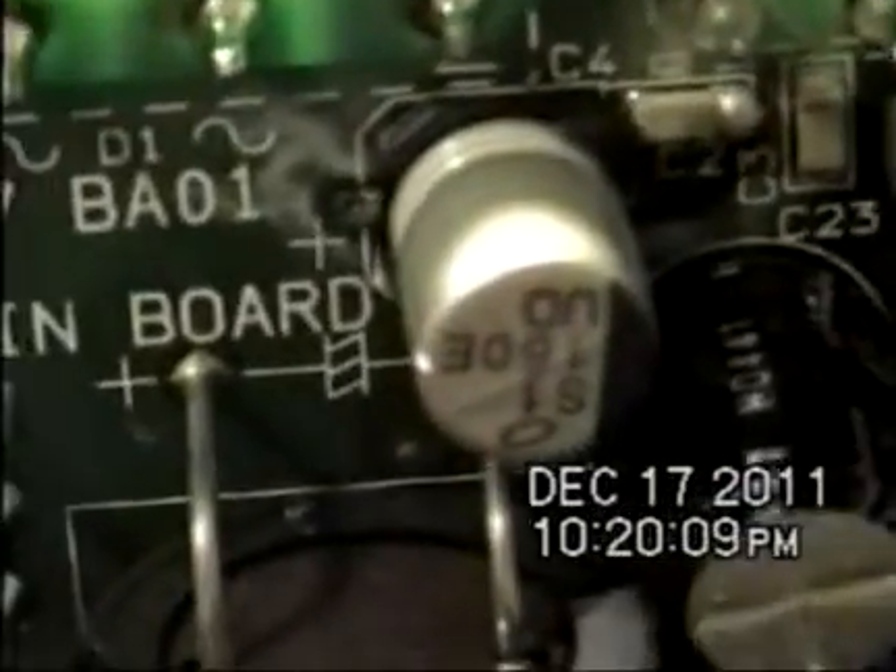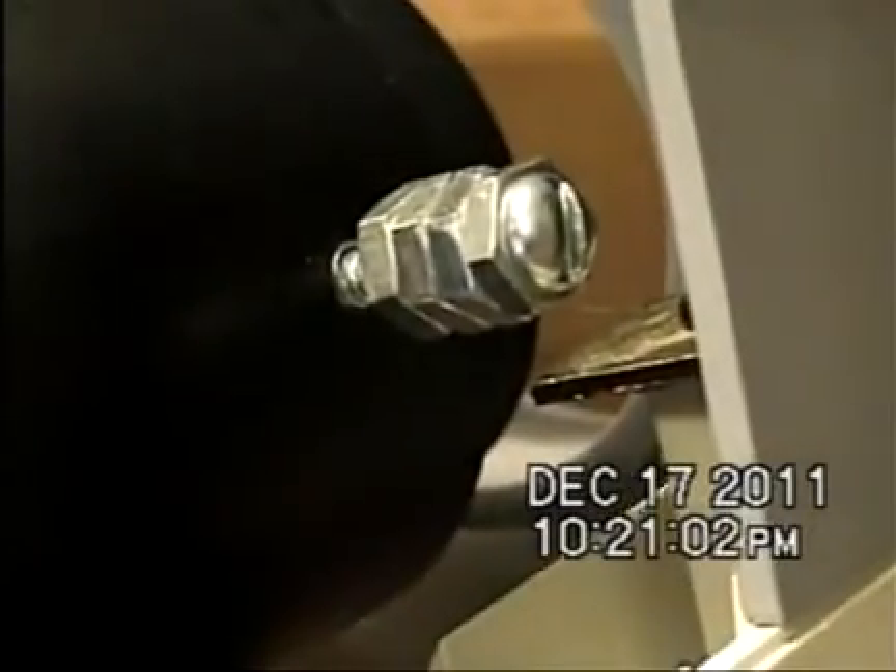This is the replacement part I obtained, and the biomedical person successfully soldered it in place without burning a hole through the circuit board — a whole lot better than I would have done. The end result is the chart works, and all that was replaced was this little capacitor. I also tried to remove the severed screw using an easy-out screw extractor, but the screw just kept disintegrating — there wasn't enough left of it. So I made this crude replacement.